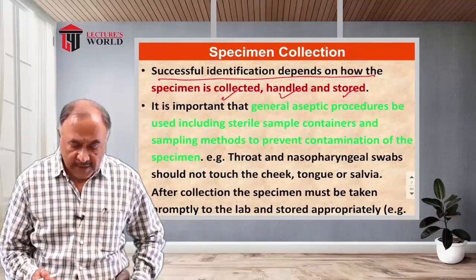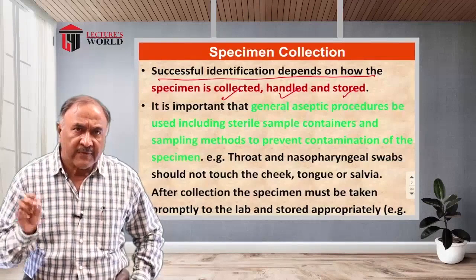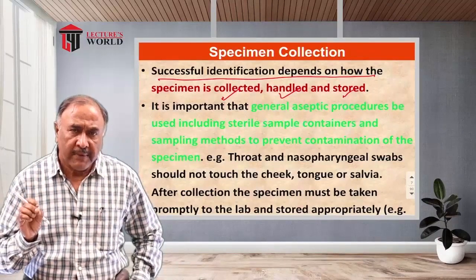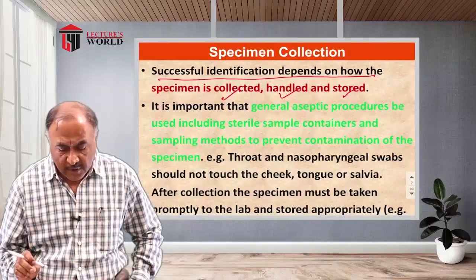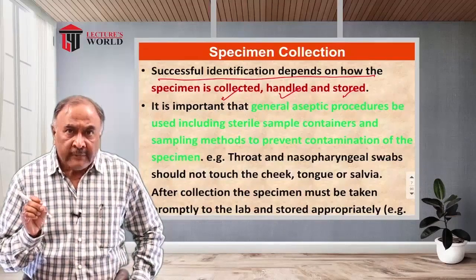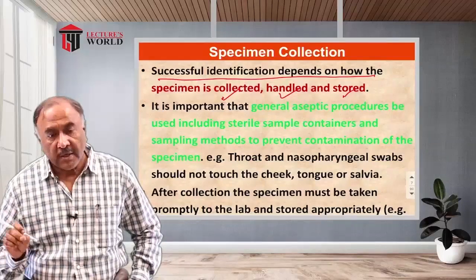First, specimen collection. As told earlier, I am repeating here that successful identification depends on how the specimen is collected, handled, stored and transported to the laboratory.